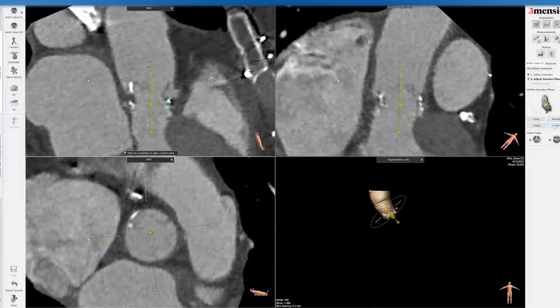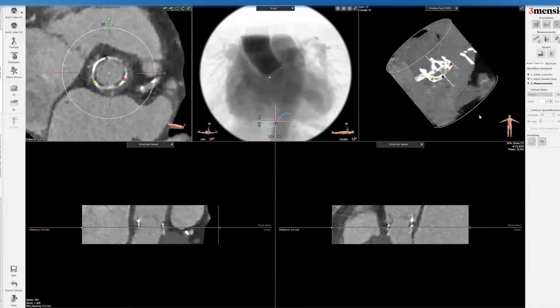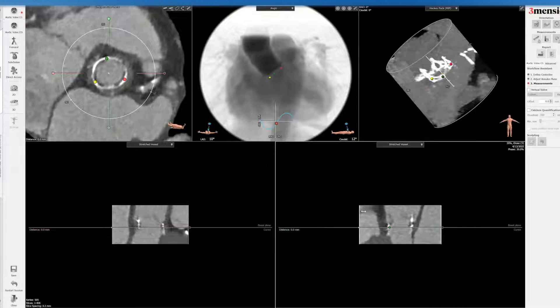Once it's done, I'm going to click confirm. Here's the root anatomy — I'm going to compress this view.